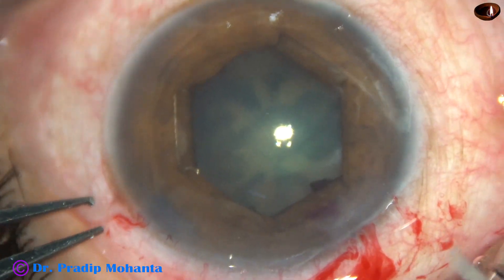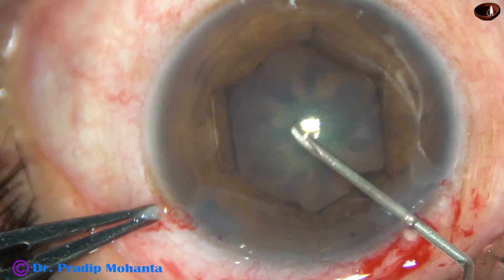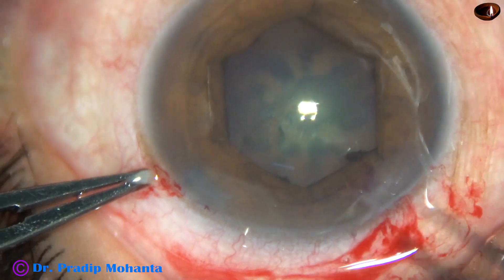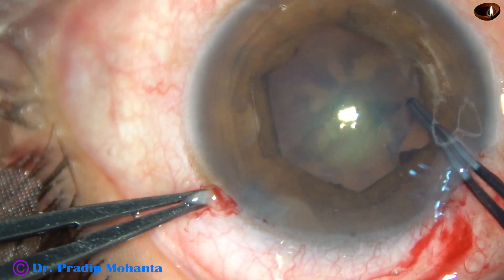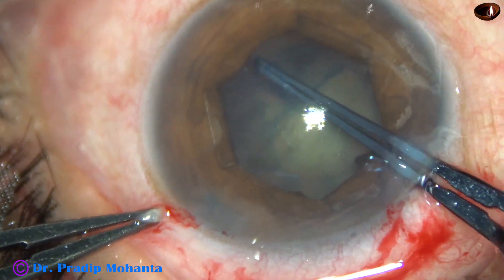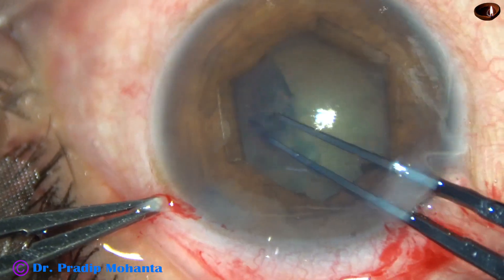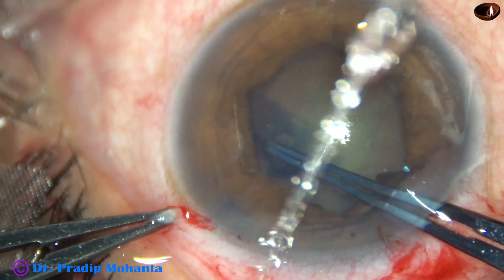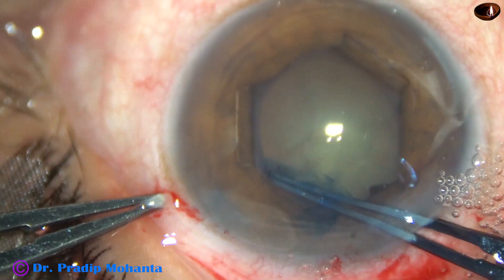The pupil has taken a hexagonal shape. Now the anterior capsule is incised and a utrata forceps is taken. This capsular tag is held and guided anticlockwise along the margin of the hexagonal pupil. Thus, we get a capsulorhexis of about 5 mm, which is an adequate-sized rhexis.